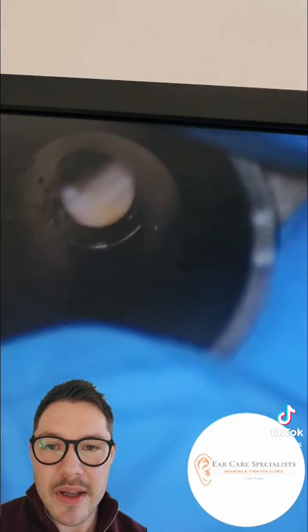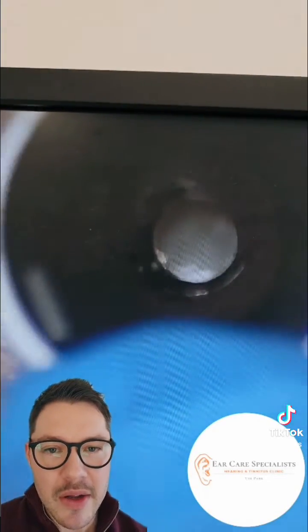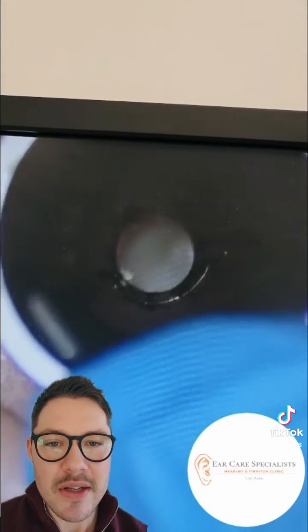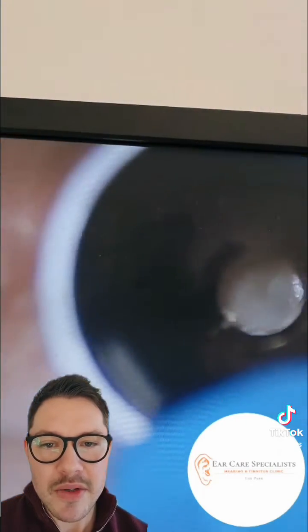I'm just putting the speculum back into the ear canal to have another good look down there and check all the wax is gone. You can see at that point this patient's ear canal is actually relatively straight, so you can just get a glimmer of the eardrum — the silvery thin membrane which is about three centimeters down the ear canal. You can start to see it there shining back at us, so that looks pretty healthy, and that's it.